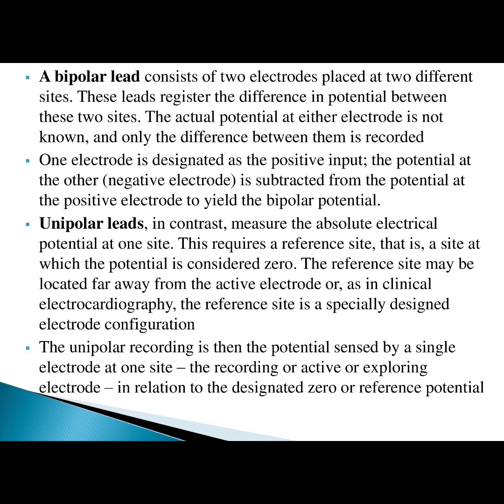Unipolar leads, in contrast, measure the absolute electrical potential at one site. This requires a reference site, that is, a site at which the potential is considered zero. The reference site may be located far away from the active electrode, or, as in clinical electrocardiography, a specially designed electrode configuration.